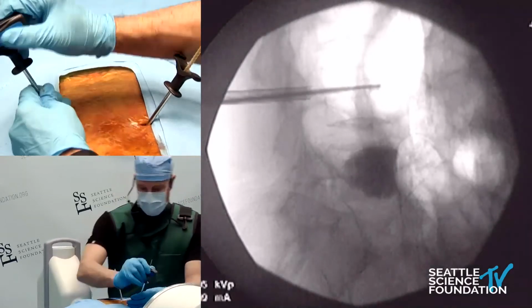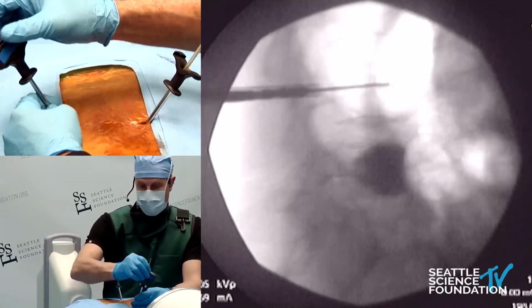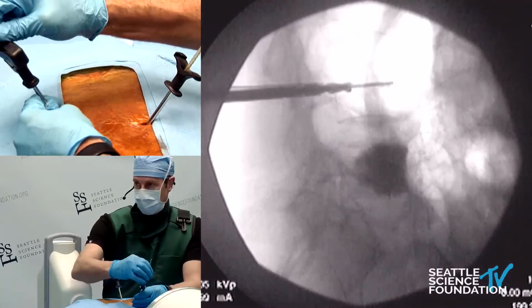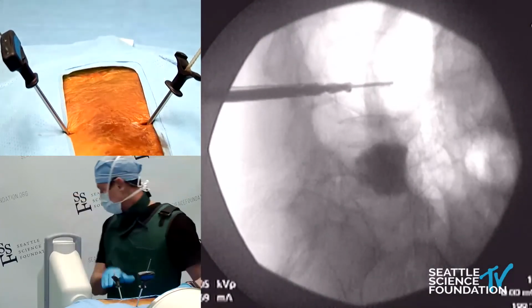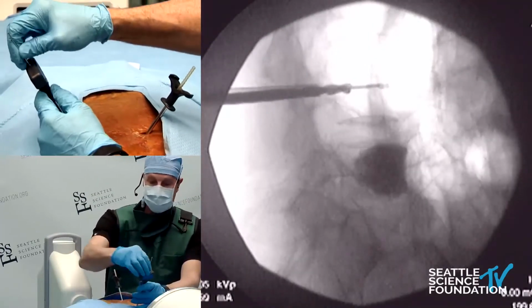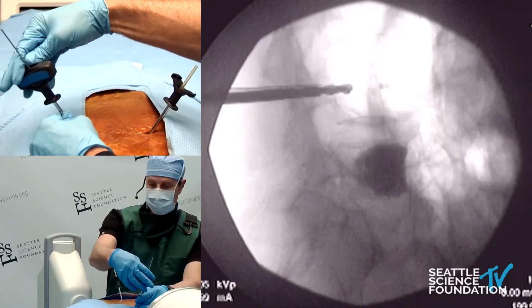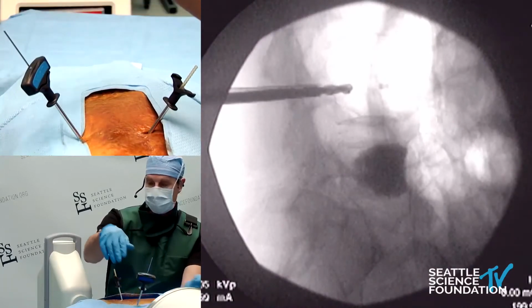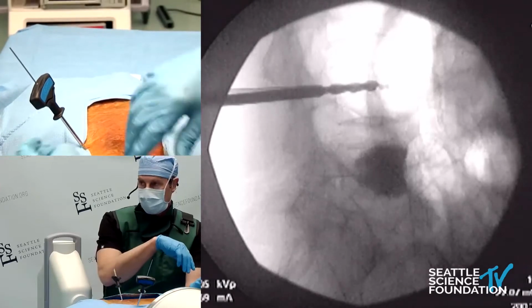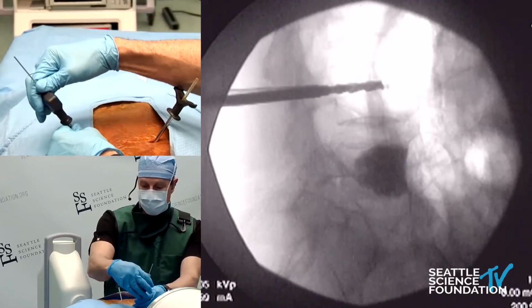It's on screen. We will access this, minding the front part of the K-wire, and I will get it into the posterior third, and then I will pull the wire back. Okay, wire comes back, and as I advance, I'm going to medialize this, and you can only medialize it. Do not rocker arm this thing. Medialize it as you turn. So I'm medializing this as I'm turning, and we will have a little bit of correction as we get out to the front part of the vertebral body.